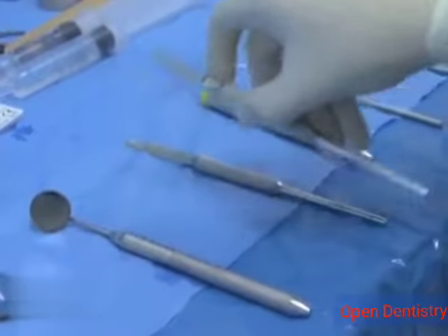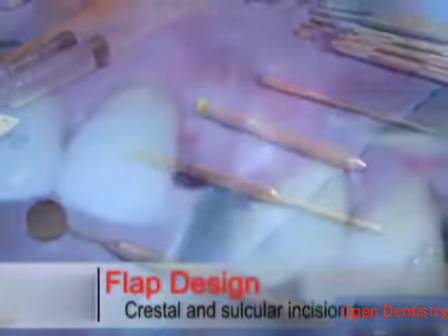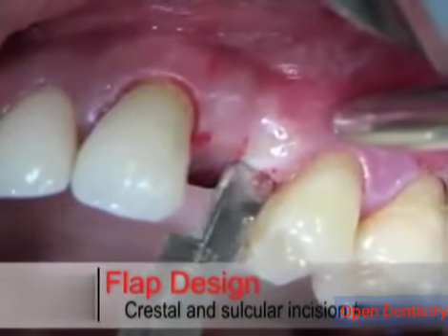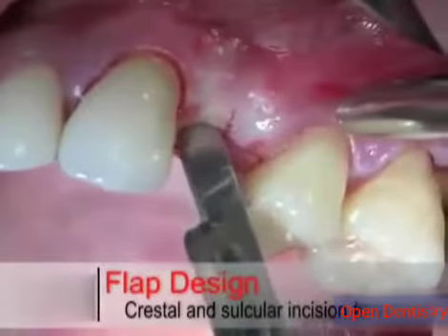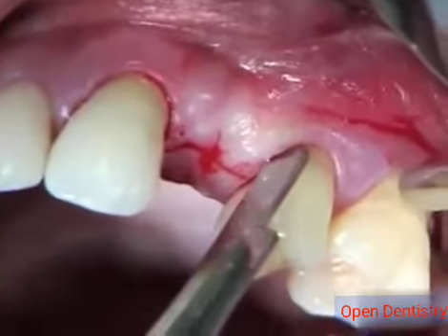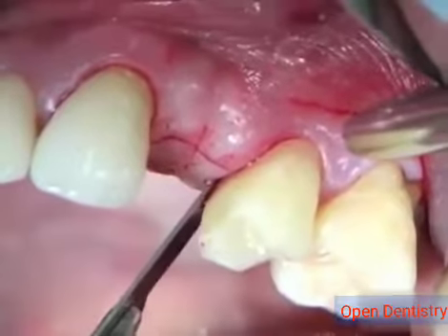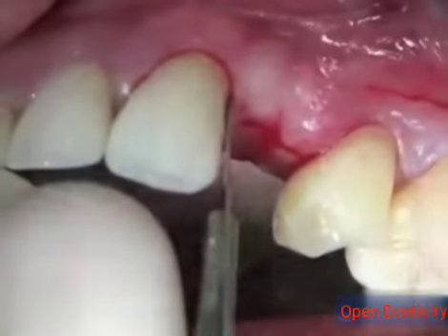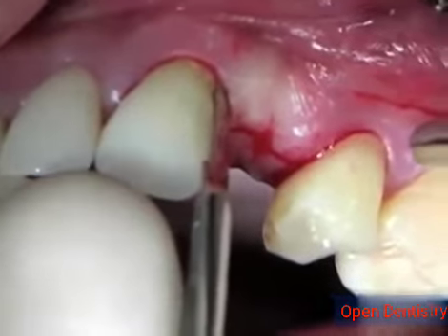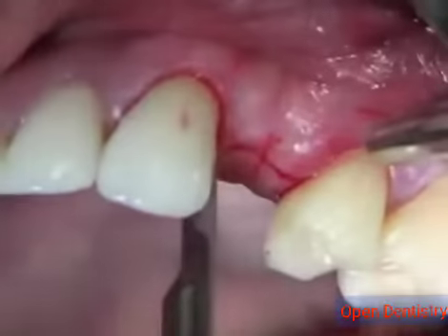The first incision is applied using a number 15 blade, going through the crest, then going through the buccal sulcular to the palatal sulcular, and the other adjacent tooth going through the buccal sulcular and the palatal sulcular. Very precise and careful incisions are made.